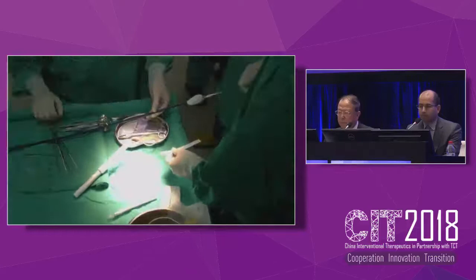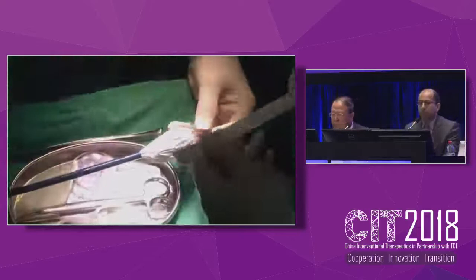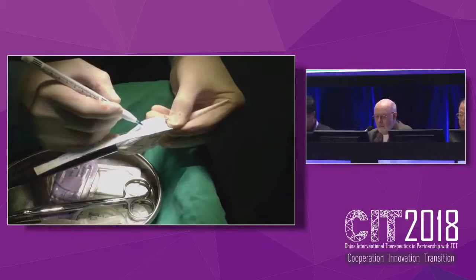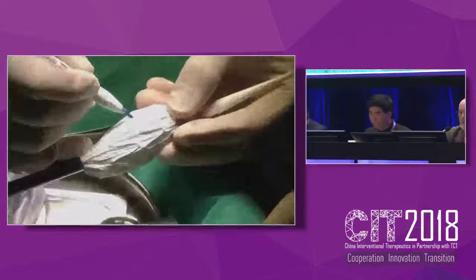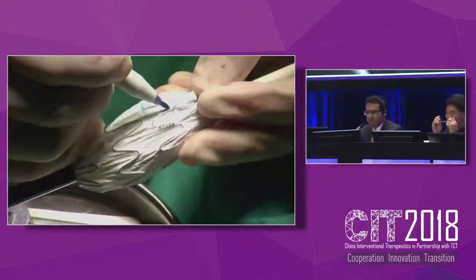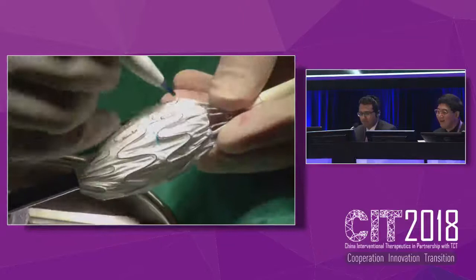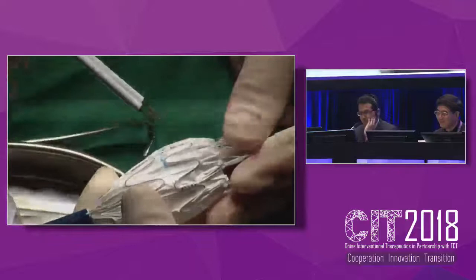So are you going to show us some of the in situ fenestration that you're going to be doing now? Yes. Would you please focus on the stent graft? So now we just release part of the stent graft. Then we calculate and make the mark. As we just calculated, we'd like to make a big fenestration because the PAU is very near to the left carotid and the left subclavian. So we have to make a huge fenestration. So we will make a fenestration from the beginning.